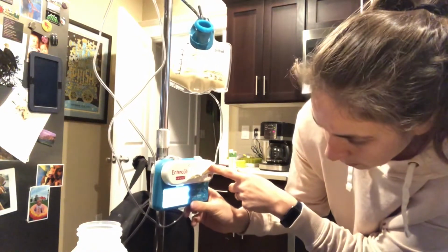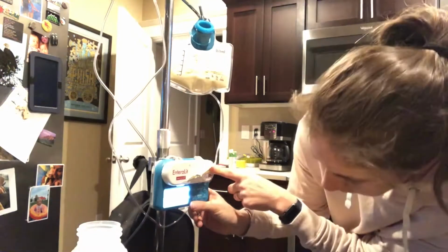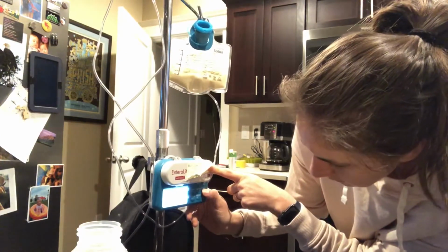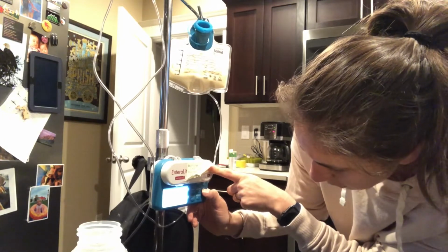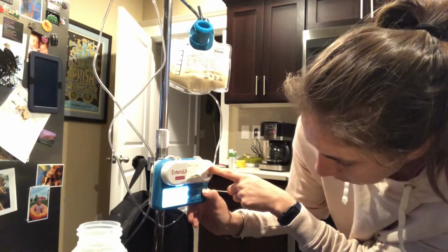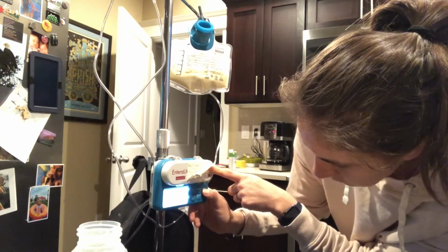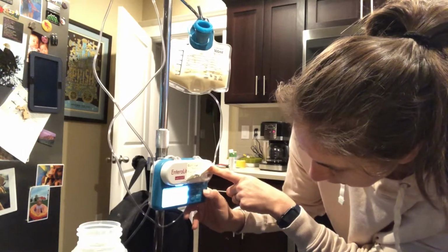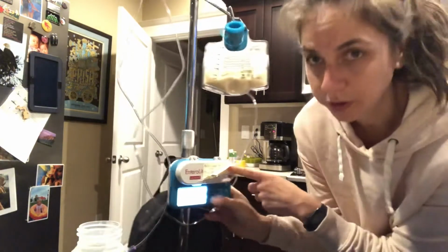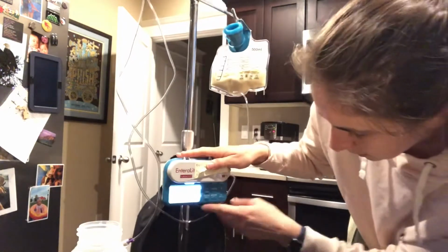And it should already be set to her rate, which is 305 milliliters an hour. So you just make sure that it says 305 ml-HR, and I'm just changing it right now from her night feed, which is obviously much slower. I'm putting it back up to 305. And then it will just say 305 on the screen. I know it's hard to see on the video, but when you actually see it, you'll be able to see it.